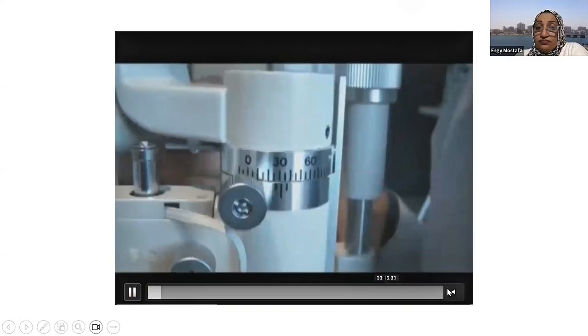You can see also if there is trichiasis or if there is infection accompanying them, and also you can do the fluorescein dye test, the tear breakup time and the Schirmer test. Most of them are done in an outpatient setting, not needing any investigation, which can lead to a very definite diagnosis of dry eye.